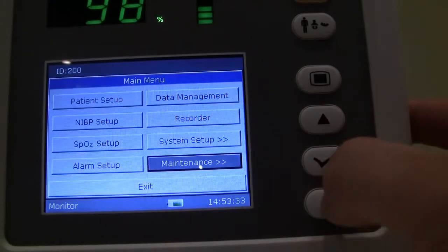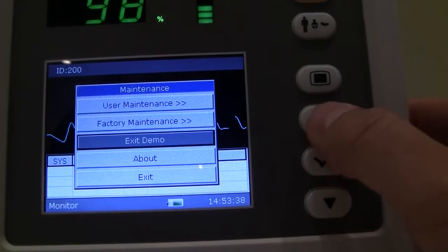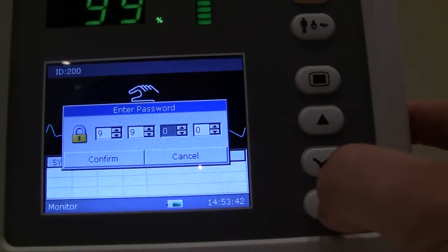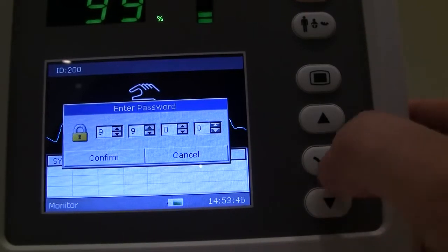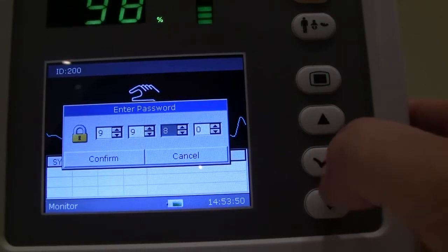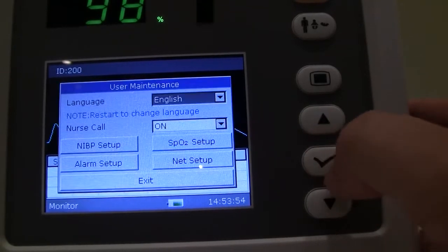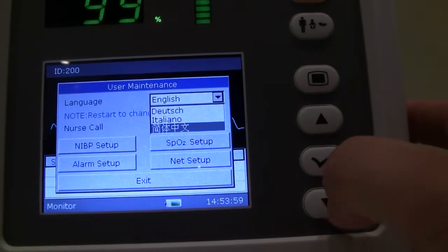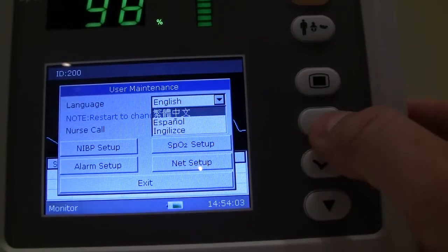System setup, we actually went through that. Maintenance, there is again the user maintain. If you want to go in here to this user maintain, the password to do so is located in your manual. I believe that it's 9981. In here you can select your language. It's defaulted by factory default as English, but several languages to choose from here in this screen.